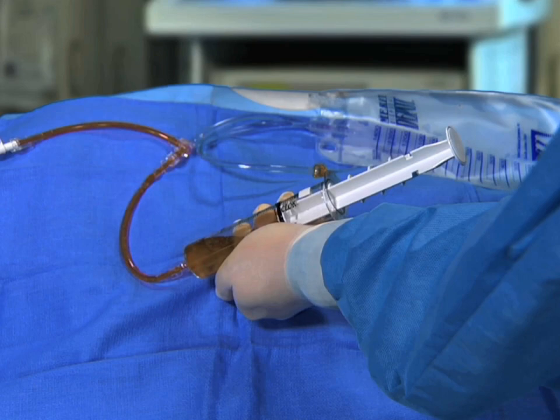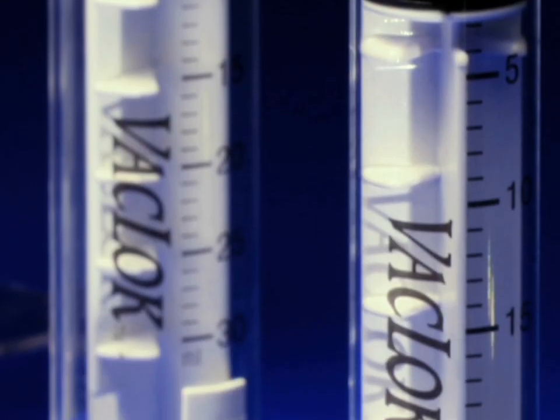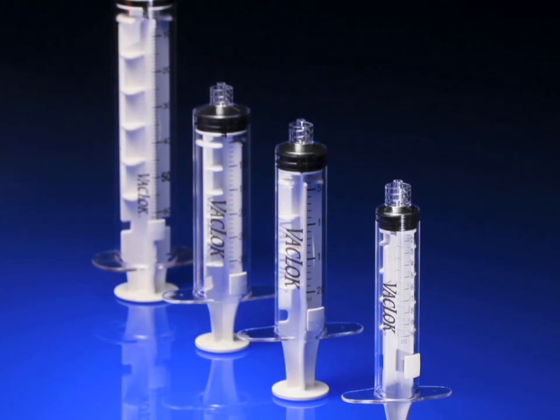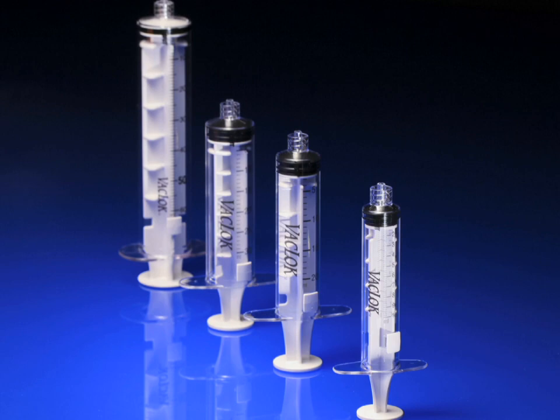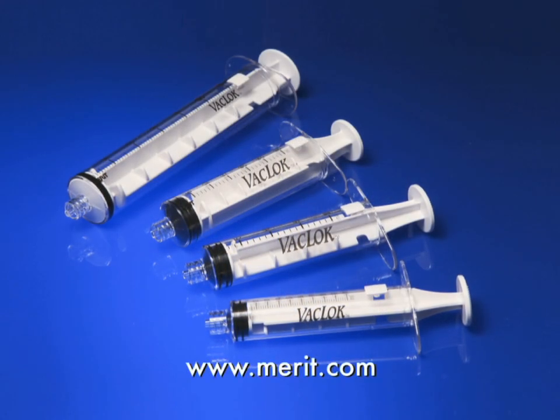The Vac Lock Syringe — a unique innovation by Merit Medical designed to minimize hand fatigue and increase procedural efficiencies. To place an order today, contact your local Merit Medical sales representative, or for more product information visit the Merit Medical website at merit.com.